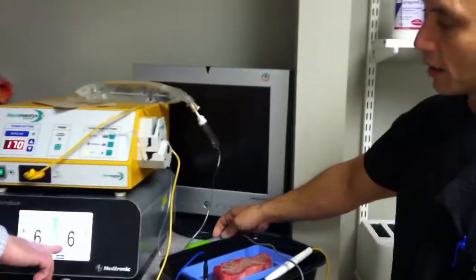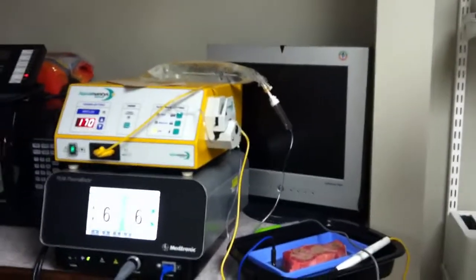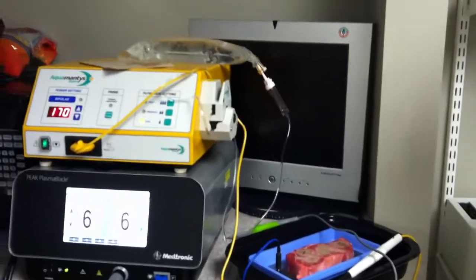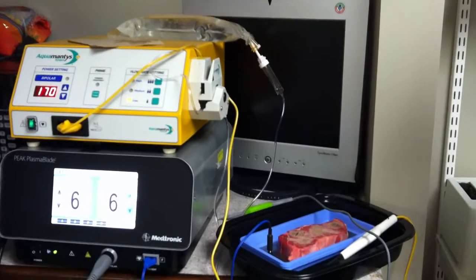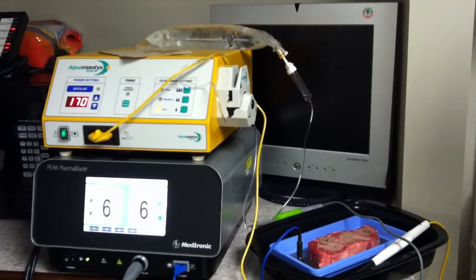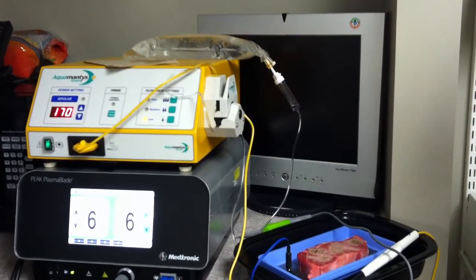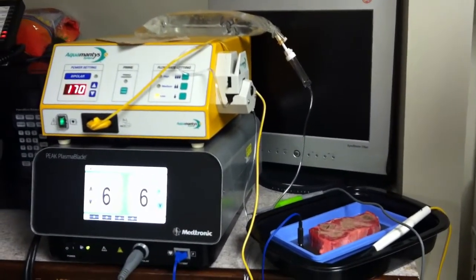Because, I mean, at 6 and 6, we're operating about 85 degrees Celsius. Wow. And the Bovie's up to 350, you said? At a setting of 50, you're going to be above 300 degrees Celsius. If you're on 25 coag, you're still about 250. Okay. So I find that 6 and 9 is kind of nice. You get the best of both worlds.